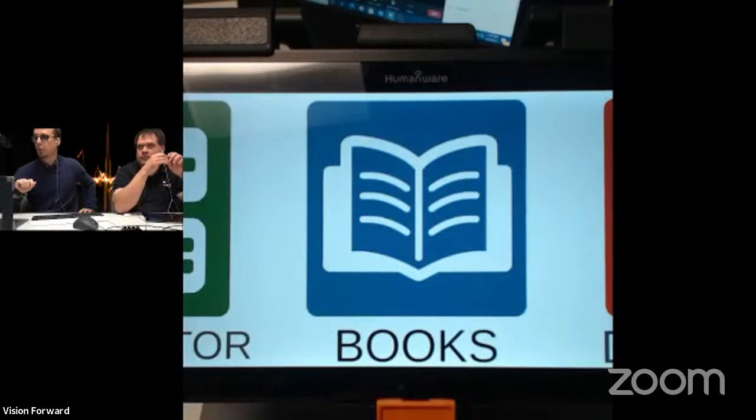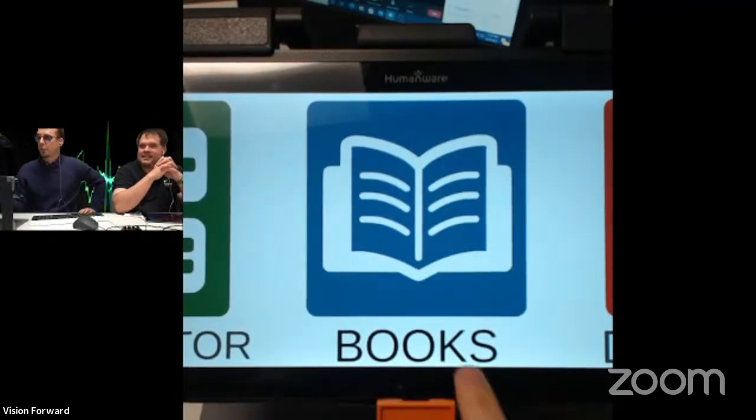Yes, and somebody also said the Reveal 16i. Yes, that's true, but that one's not so portable. So we'll be showing that one in a different category in a moment. Anyway, getting back to the Prodigy software here.